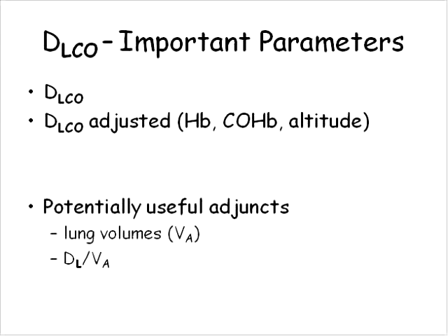And really, we only need to be concerned about the DLCO value itself and whether or not we need to adjust that value for any of the parameters that you see listed there. Again, the ATS-ERS guidelines recommend adjusting the DLCO for hemoglobin, carboxyhemoglobin, or for the altitude of the laboratory as appropriate. These adjustments tend to be most important when the patient has a DLCO that's near their lower limit of normal.